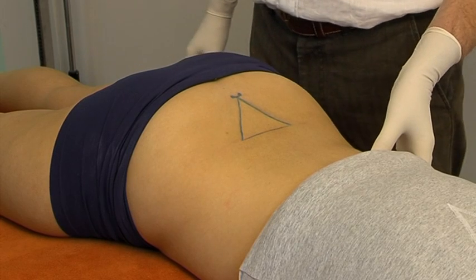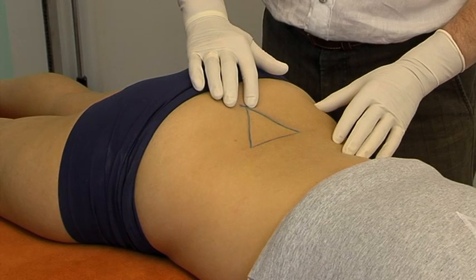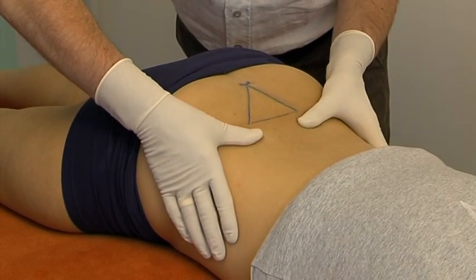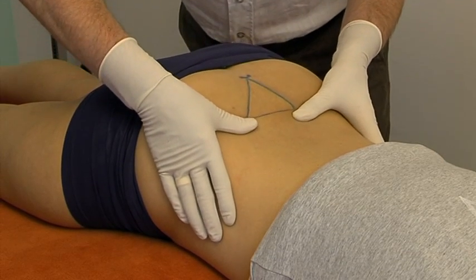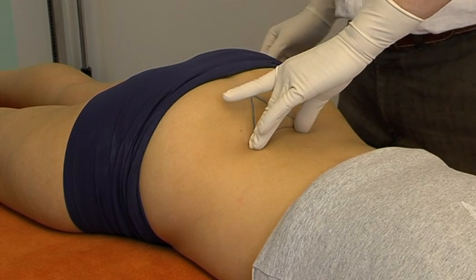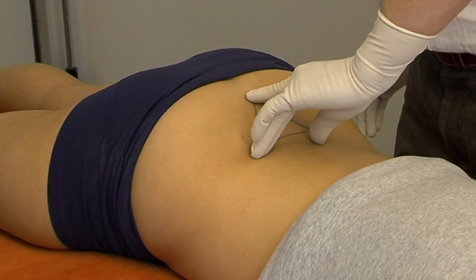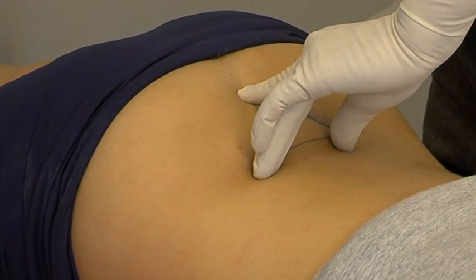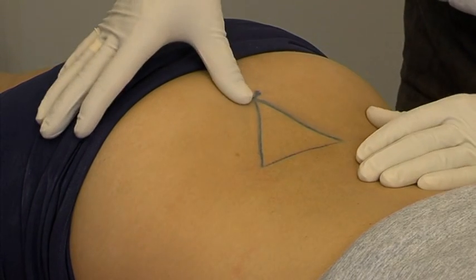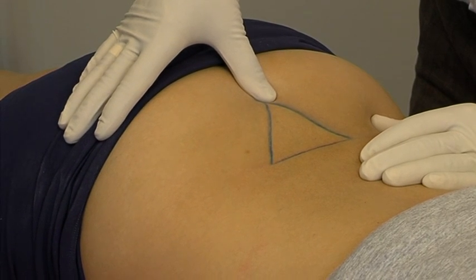The most important marks are the two cornua sacralia. The cornua are best found in the following way: the posterior superior iliac spines are marked. The thumb and middle finger are placed on the spina iliaca posterior superior, then the index finger is moved caudally in the midline until an equilateral triangle is formed. At this point, the two cornua may be located under the median sacral crest and marked.